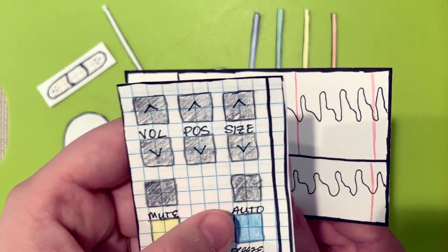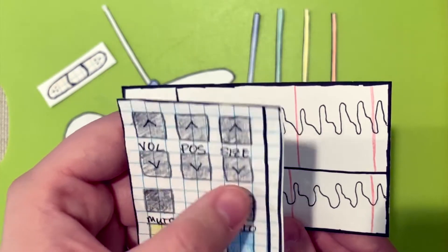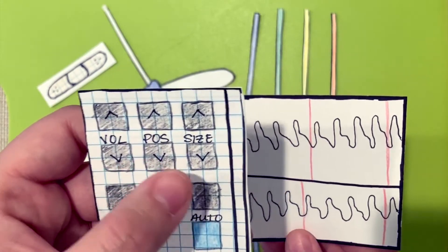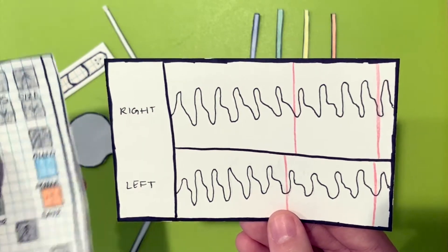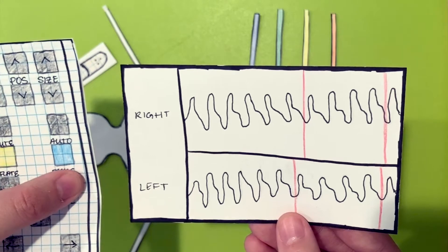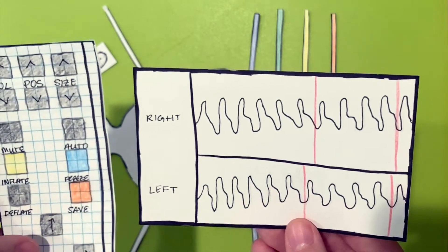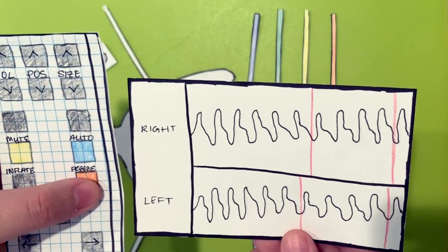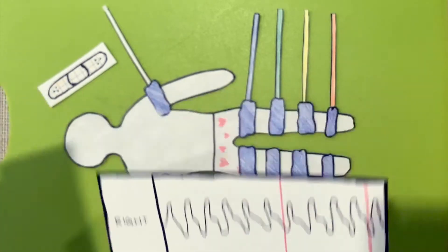If the waveform is too small or too low or too hard to hear, you can turn these settings up or down with the remote. Once a good set of waveforms is available, freeze, select the set you want, and acquire them with the save button on the remote. Continue down the leg until all the sets are acquired.